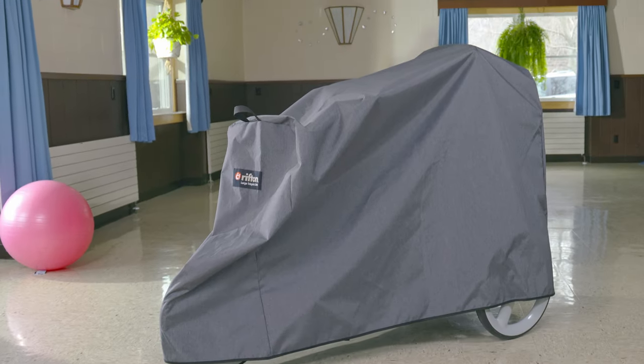Finally, the outdoor cover — it's weather resistant for storing your tricycle outside. Thanks for staying with me as I reviewed the features, positioning options, and therapeutic benefits of the Rifton Tricycle. Please don't hesitate to reach out to sales at Rifton.com with any questions you may have.